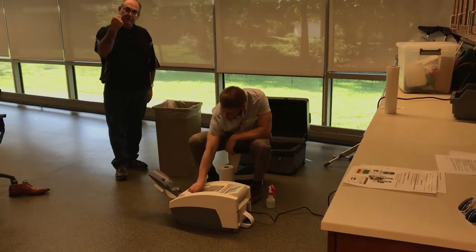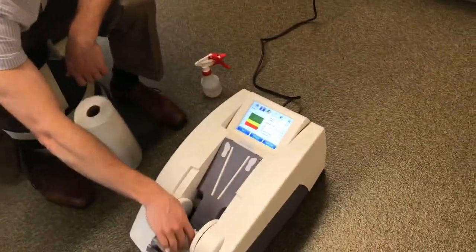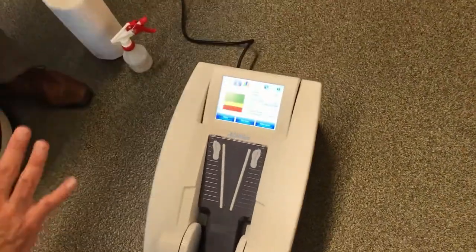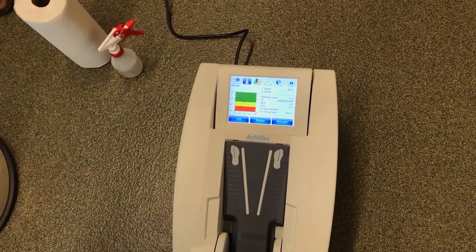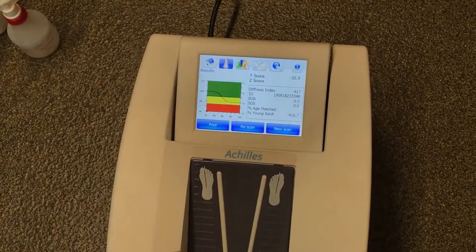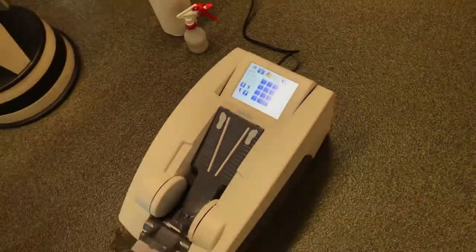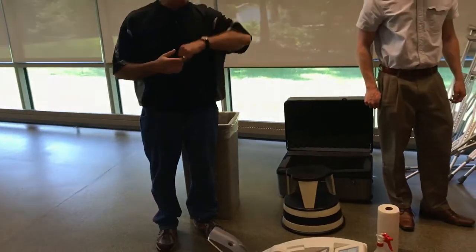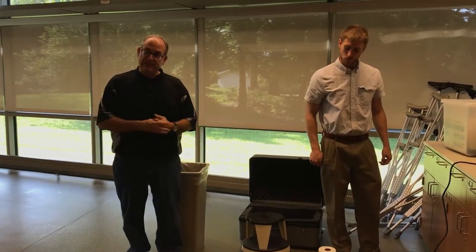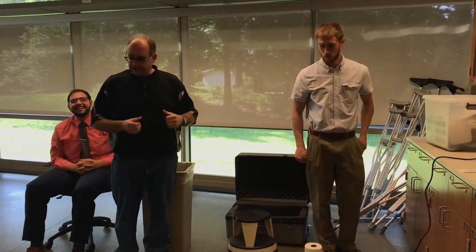From the pharmacist's perspective, come back here to see the screen. If the test were to fail or if we didn't get a result, we could re-scan that same patient without them having to take their foot out or re-enter information. But since we got a good result, what we would do is hit the new scan button, and that just takes us back for the next patient. At this point we're done with the test for this patient. We would pull off their test results, talk to the patient about the results, and explain them. That concludes a single iteration of doing a test for a patient.